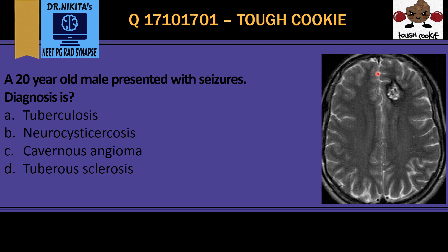This is an MRI — we know it's an MRI because the bone cortex here is black. It is a T2-weighted MRI because the CSF in the sulcal spaces is white, and we know that water is white on T2. So this is a T2-weighted MRI of the brain, and we see a lesion here on the left side.